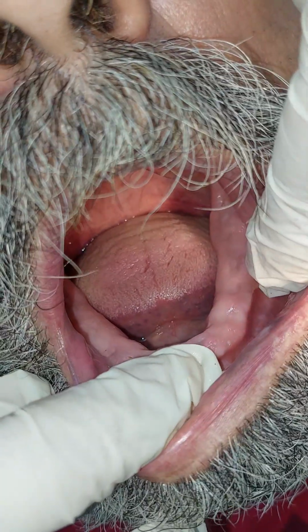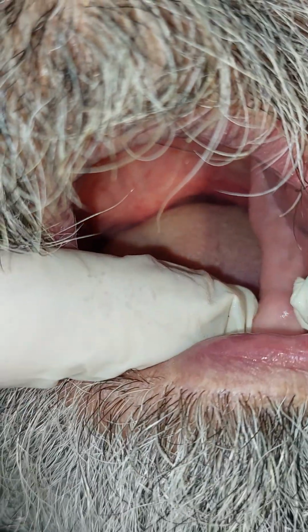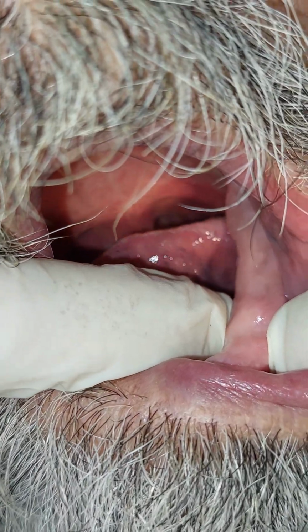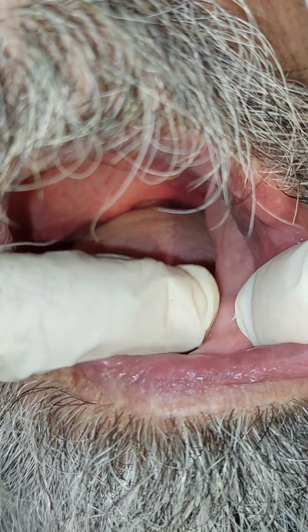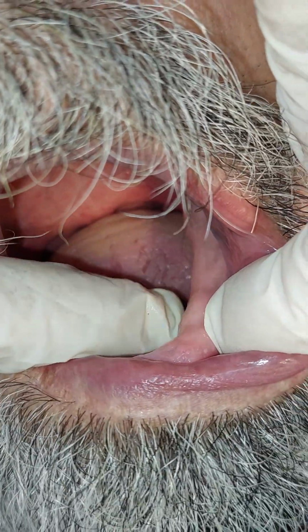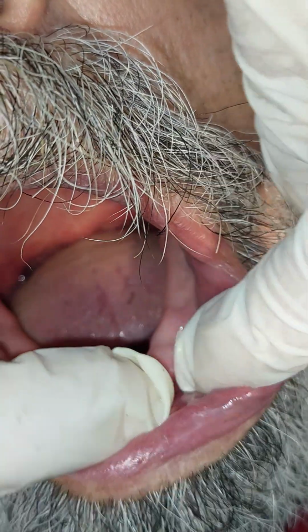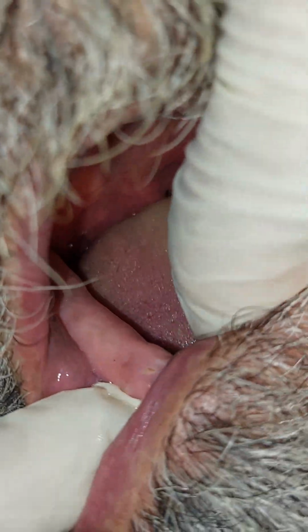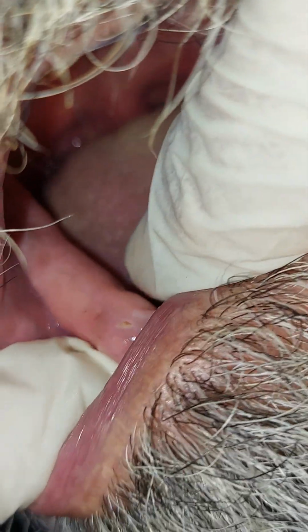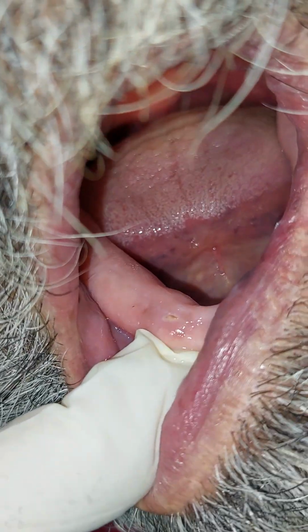In some cases, if I could not place a denture because this undercut is opposed by this undercut, they're totally opposite, what should I do? There are multiple options. One of them is surgery, where I could open a flap and shave the compact bone, osteoplasty. I change the shape, where I remove the bulgy areas that are opposing each other. Look at this sharp one here, for example. See this sharp one? And it's opposed by this one, lingually. So these are very opposite. And if I'm going to put a denture in and out, it will be traumatizing for the patient.